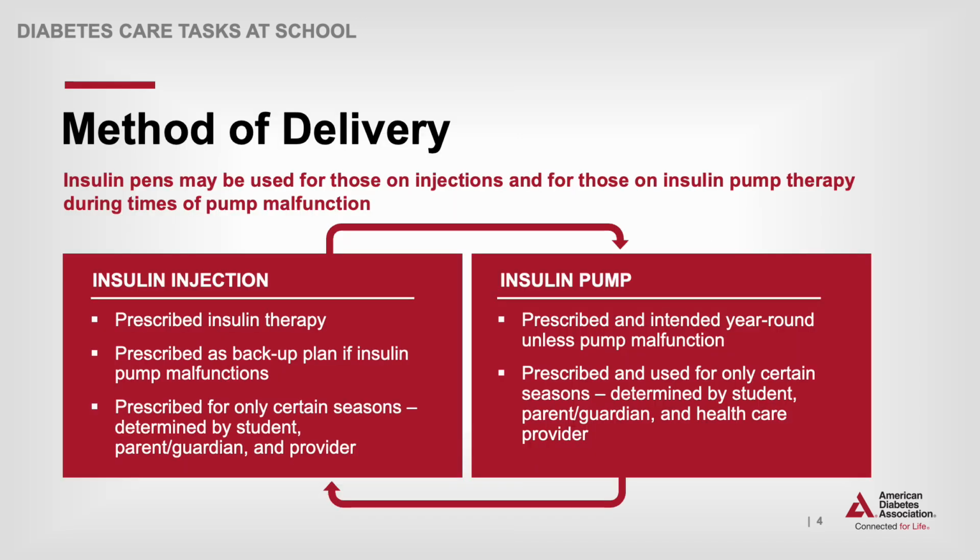Method of insulin delivery is determined by the student, parent or guardian, and provider, and therapy may change. Some students may only ever use insulin injections, while others may transition to insulin pump therapy, which will be discussed in another separate unit on insulin pumps.